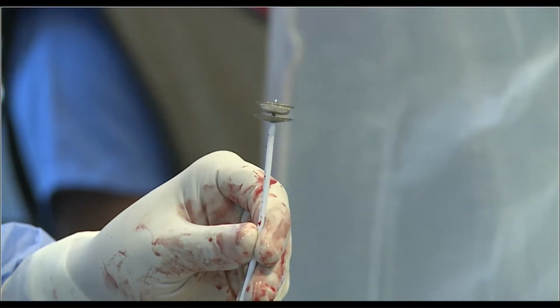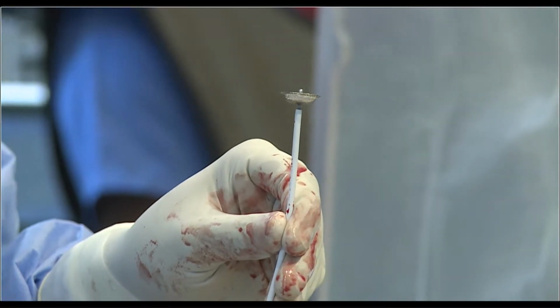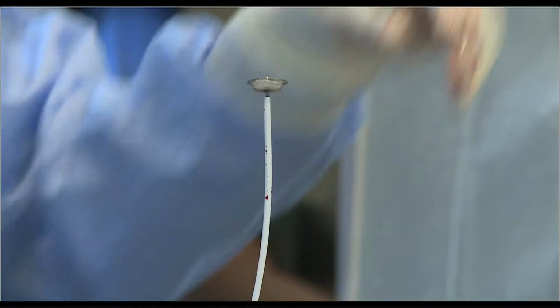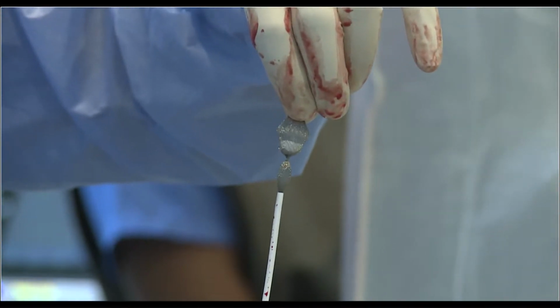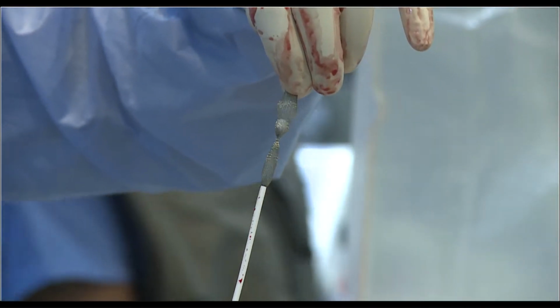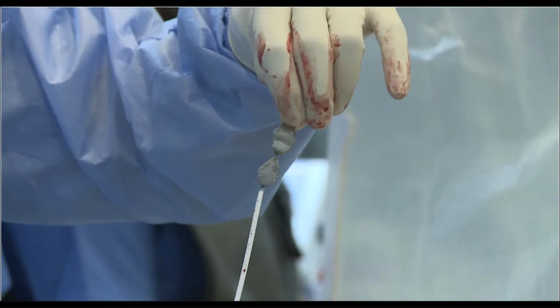The distal end of the MFO is like an ADO, but it is very short in its length, and then it has got a retention skirt on the right side. If you carefully observe, there is a single layer fabric in the middle belly. This fabric is there in the larger 3 sizes, that is 10-8, 12-10 and 14-12, whereas the smaller devices like 6.4, 7.5 and 8.6 do not have a fabric.